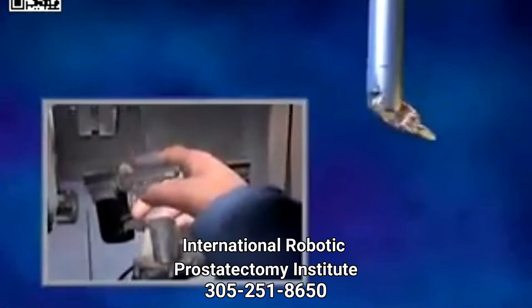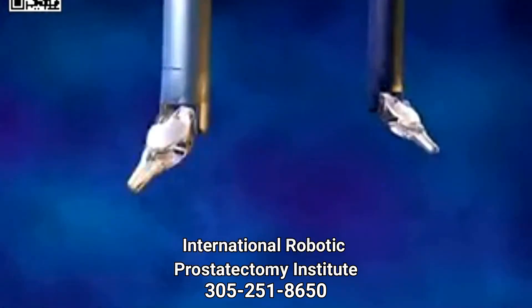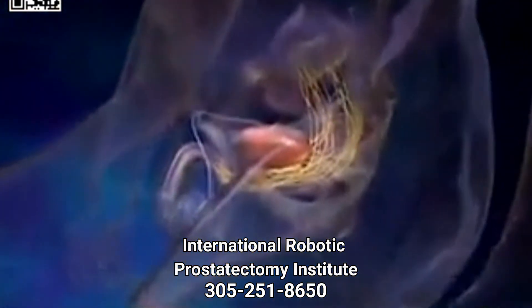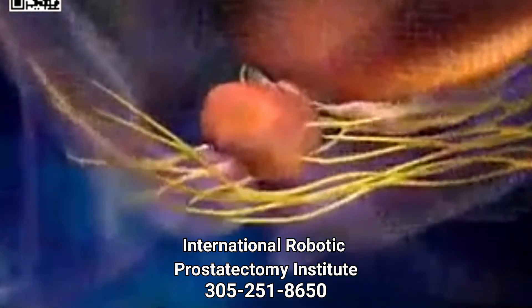Unlike standard laparoscopic instruments, the specialized da Vinci instruments can articulate and rotate 360 degrees with unparalleled precision and flexibility. The camera of the system provides the surgeon with a remarkably clear, three-dimensional view inside the body.